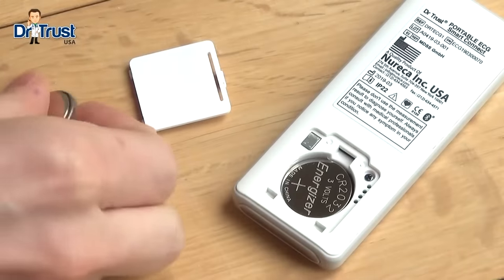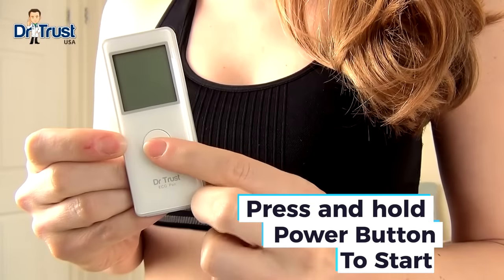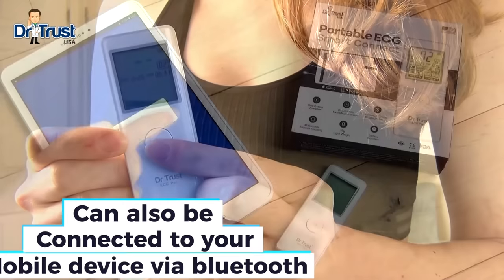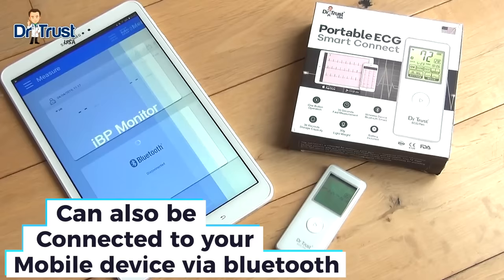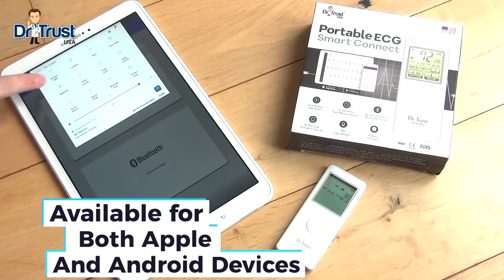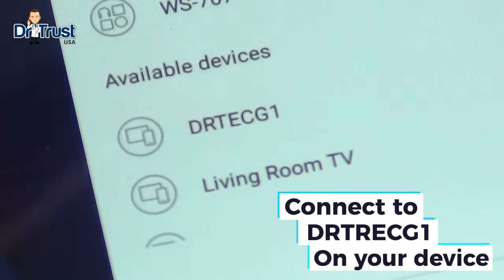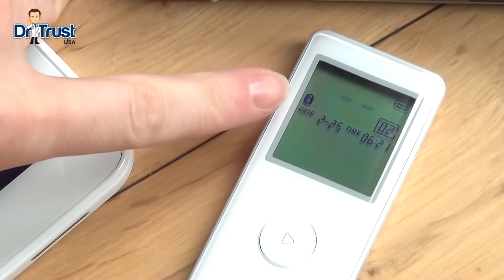To get started, insert the batteries provided and turn the device on by pressing and holding the power button. You can take a reading on the device alone or connect via Bluetooth to a mobile device or tablet and use the IBP Monitor app, which you can download from the App Store or Google Play. With Bluetooth enabled, open the app and scan for devices. Once connected, you'll see a Bluetooth symbol on the device.